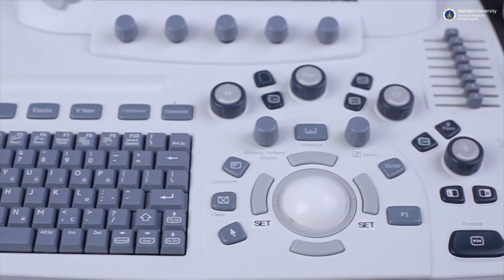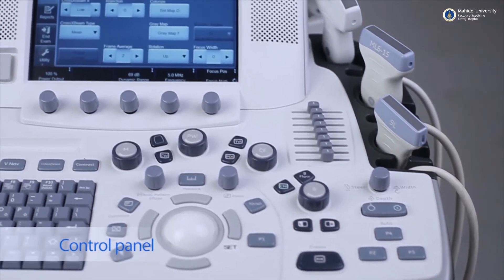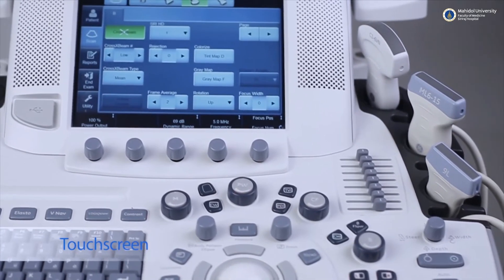The machines consist of an image display screen and a control panel. Newer machines may even have a touch screen panel for easier use.